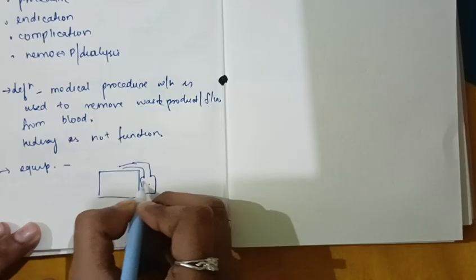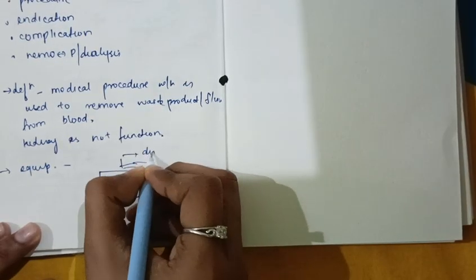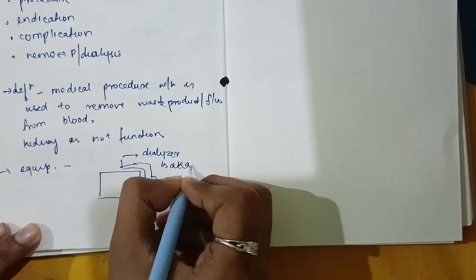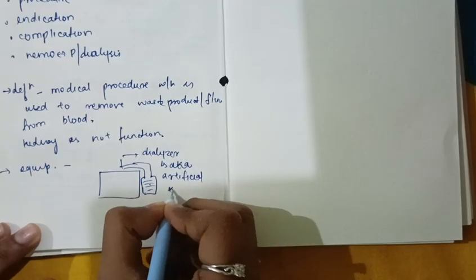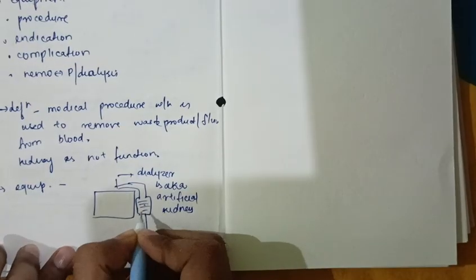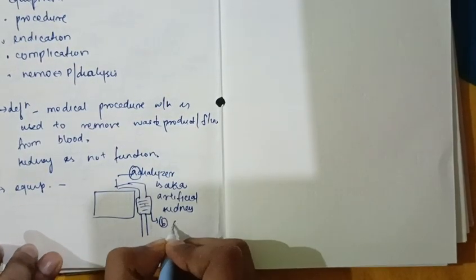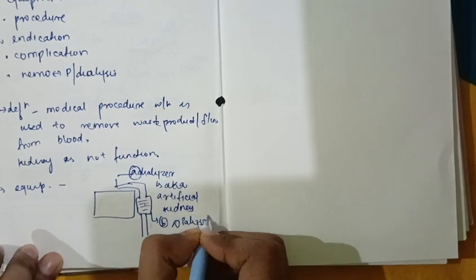It is also called an artificial kidney. Now here in the dialyzer, dialysate is present. What's dialysate? It's a solution.